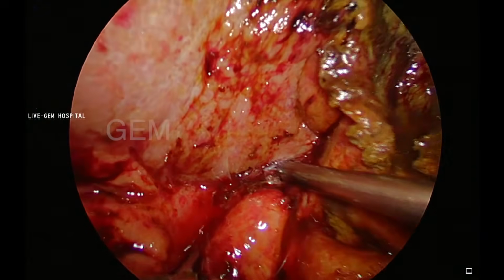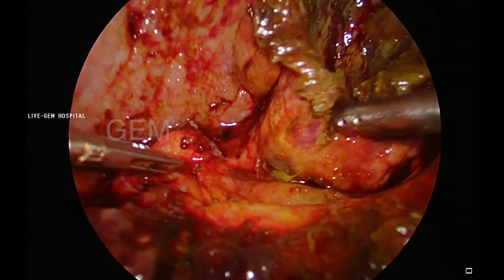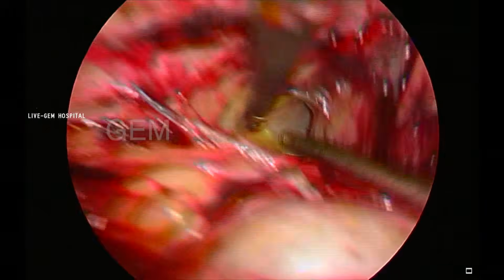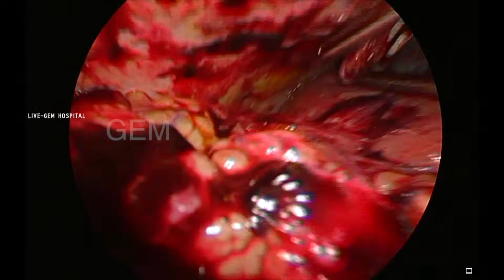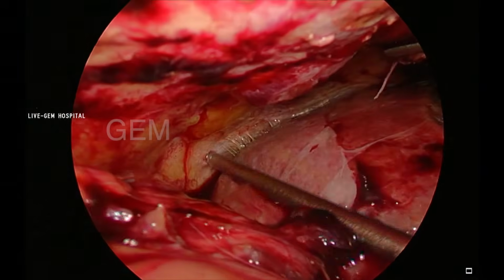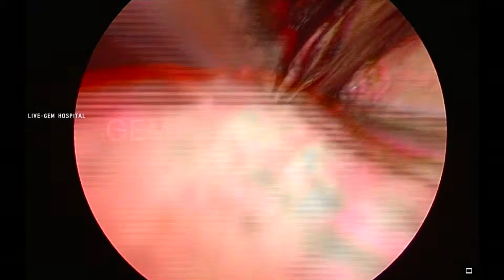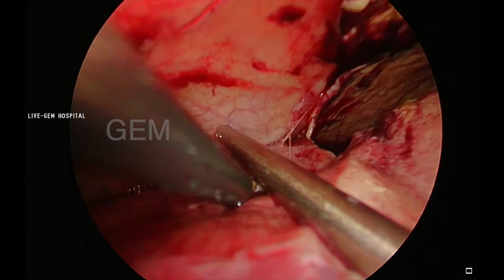Always we try for clipping of the cystic duct in all cases. Very few cases, I can say in my practice less than 1% of cases, will go for a subtotal cholecystectomy, because nowadays our anatomical knowledge is good, we have a good imaging system, and preoperative imaging like CT or MRCP also helps. So we see the preoperative anatomy, and in most cases we are able to go to the cystic duct and clip it.